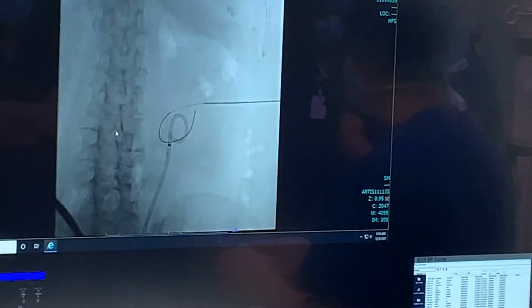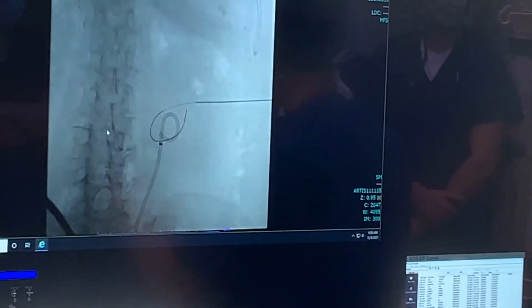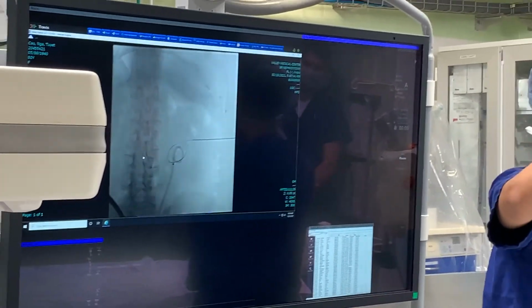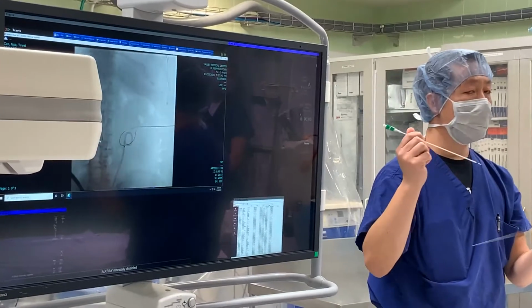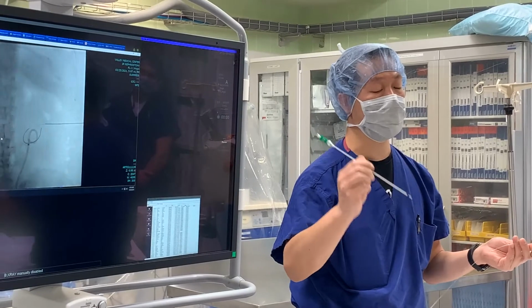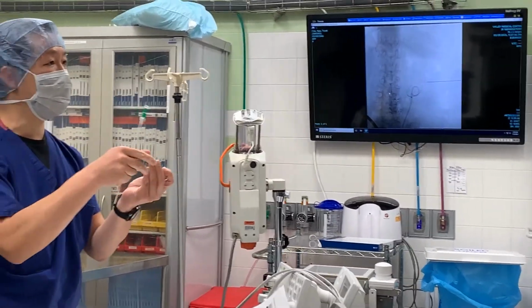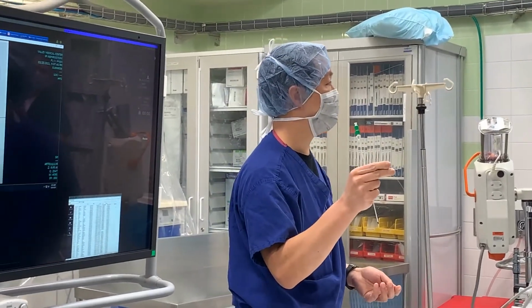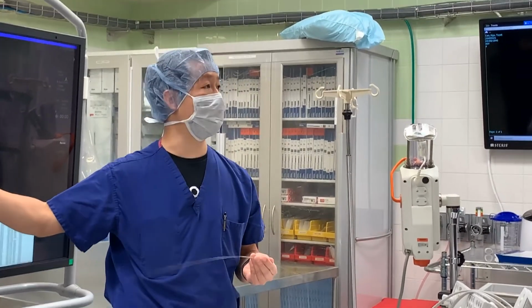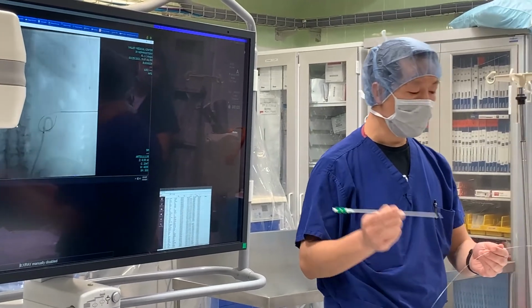Okay? You've got a problem if you don't have a straightforward trajectory, if the person is really thick, or this went right underneath the rib so that the trajectory is actually like this. This is the reason why sometimes we open the cones all the way so we see the entire tract from skin entry all the way in on fluoro, rather than coning all the way. It's because if you kink this, you have now lost access. And if you have to poke again and pull this out, that person might be leaking urine now through that hole, and you've got infected urine going into the body. Okay.